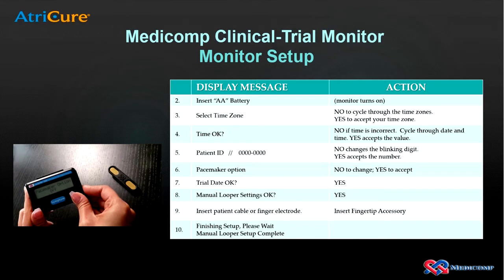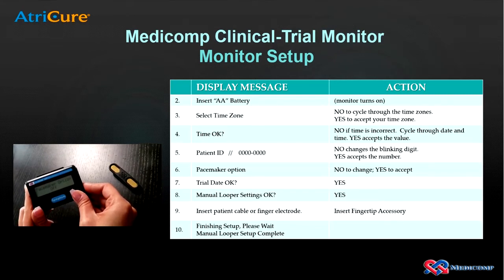Once you have entered the full patient ID, all digits will flash. Press the yes button to confirm that number is correct. If not, press no and you'll go back through the same sequence again.